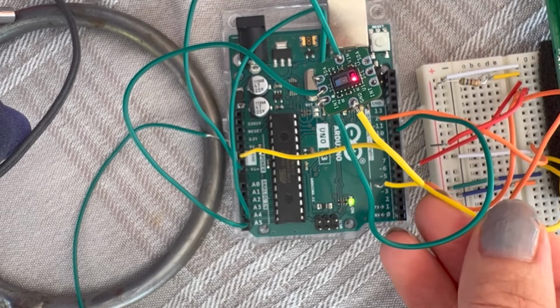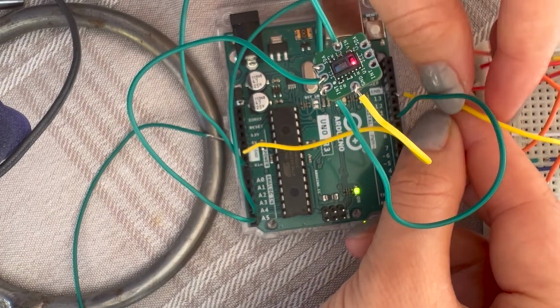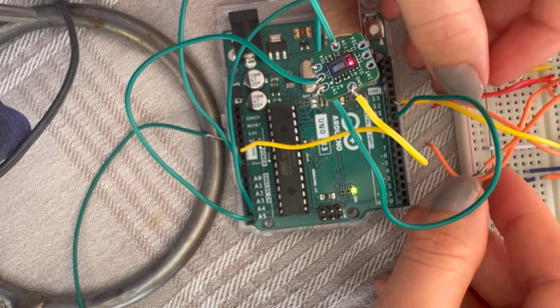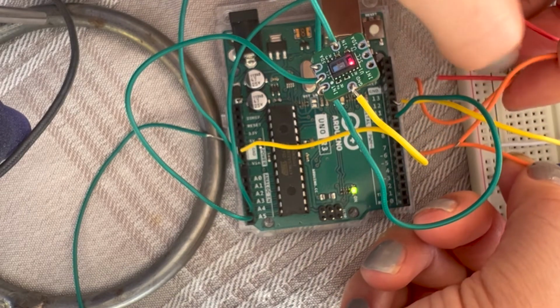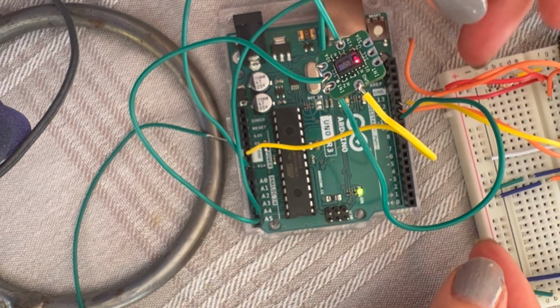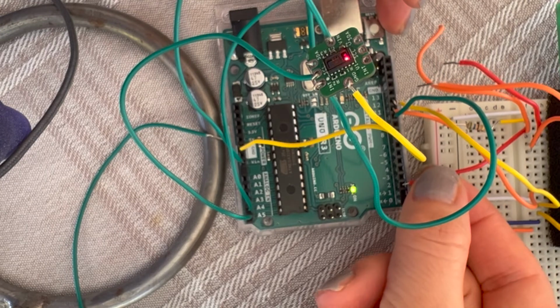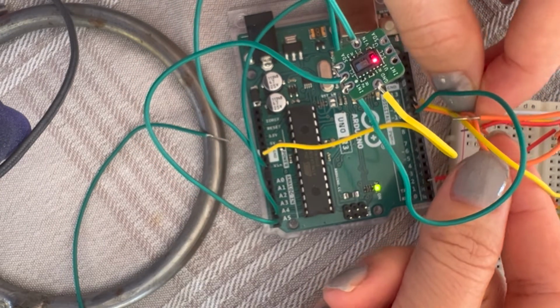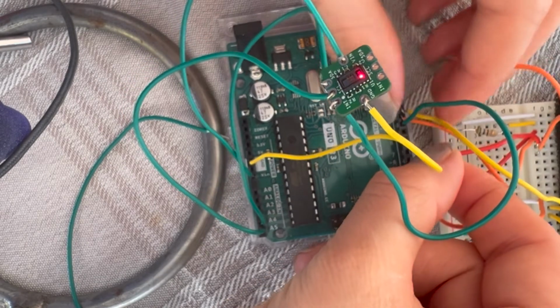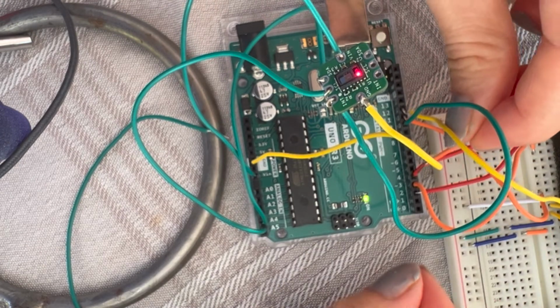So this one, I told you, which is RS, goes to 12. Now it'll be really a mess, but what can we do? Make sure that you keep track of the values. So this is the E, which goes to 11. These ones, this is the 7, goes to 2. This one is the 6, it goes to 3. The red one is the 5. This one is the 4, I guess, if you can see it.